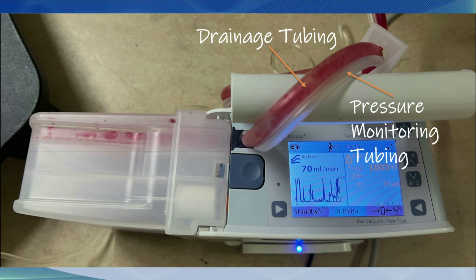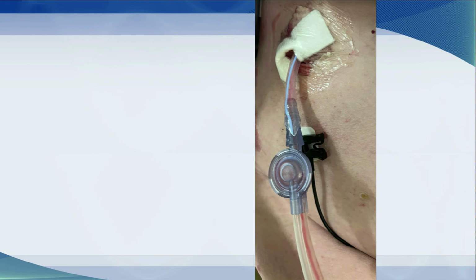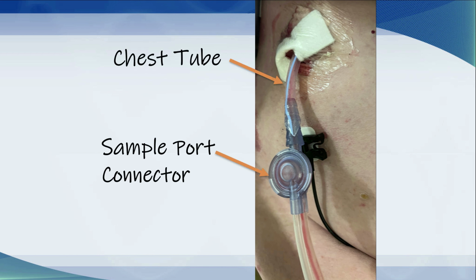On the screen you can see that the air leak is being measured. The air leak in this case is 70 mils per minute, and if you look very carefully you can see the amount of drainage that's going on. It's 1055 mils so far today and 35 mils in the last hour. If we follow the tubing all the way up to the patient, this is what we will see. This is the patient's chest tube. This is the sample port connector that connects into the chest tube, and this is the double tubing that connects to the Topaz device. Several hours later, you go back to see Noel.